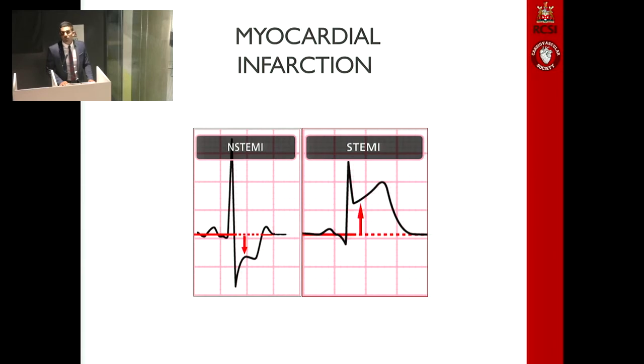Also remember that the complete blockage in ST segment elevation will remind you that there's a complete death of all 3 layers of the heart supplied by that artery. Conversely, in non-ST segment elevation MI, not all 3 layers are involved and not the entire artery is blocked off. This is analogous to chronic ischemia, in the same way that if someone was to chronically reduce the oxygen supply in a room over 10 years, you mightn't realize it and might actually have a gradual decrease in your consciousness. A depression in consciousness analogous to the ST depression or T-wave inversion of the heart.